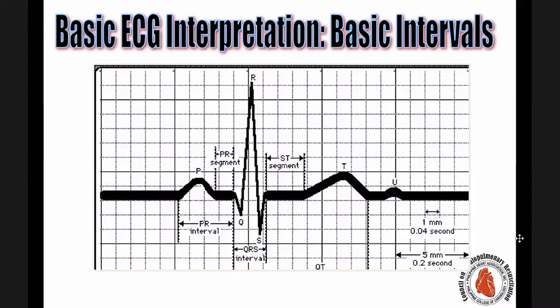And then the QT interval, this is where it varies, since it is measured from the start of the QRS complex to the end of the T. Some books say up to 50 for the QT. What I use is 50, but in books it's 46 in males and 48 in females. The values used differ, so what I just use is 50, because if it's more than 50, I'm sure there's a prolonged QT.